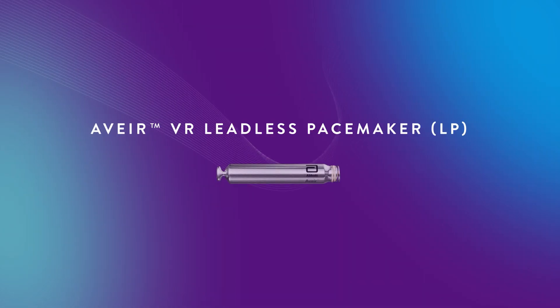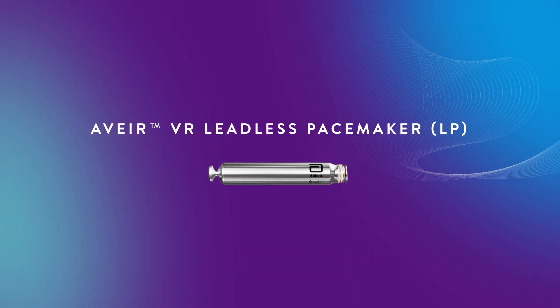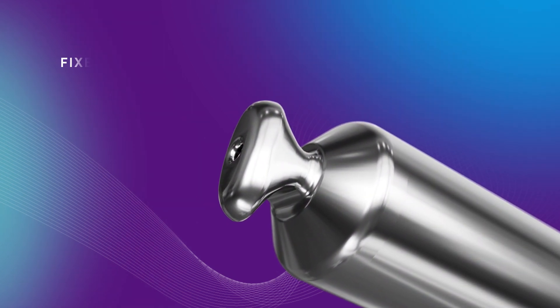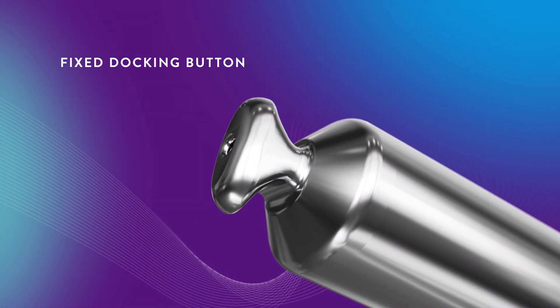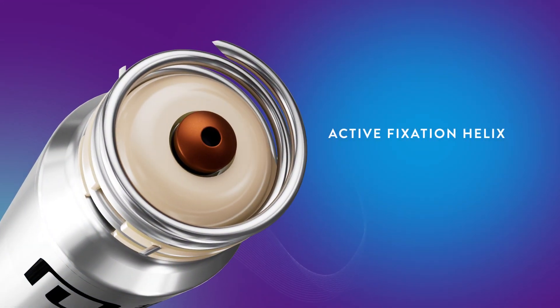Introducing the Aveir VR Leadless Pacemaker, the next evolution in leadless technology. Aveir VR LP is designed for chronic retrieval using the dedicated retrieval catheter, along with a fixed docking button on the proximal end of the leadless pacemaker and an active fixation helix at the distal end.